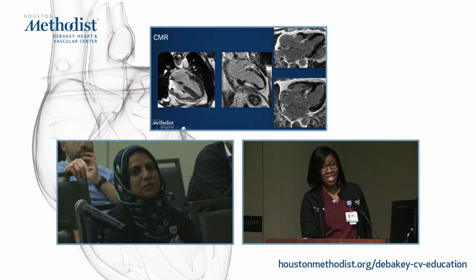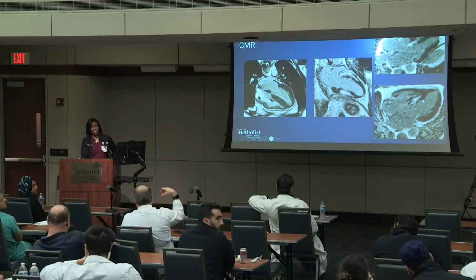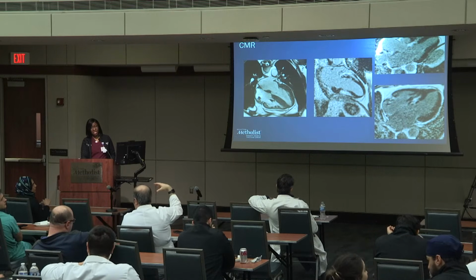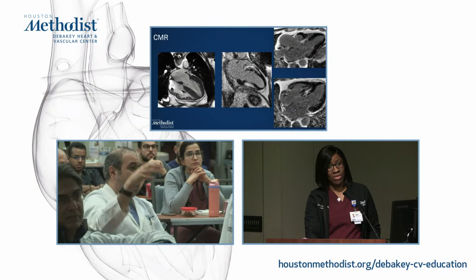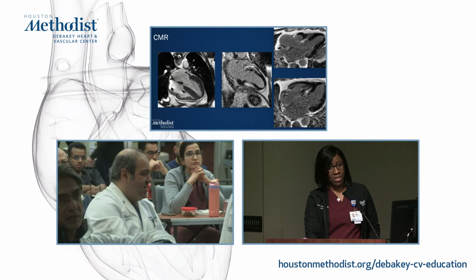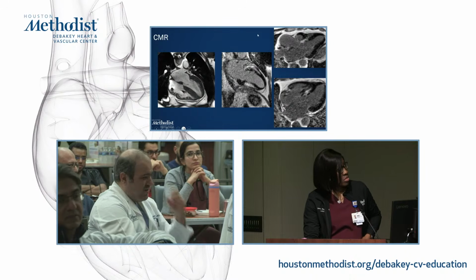And also the target of the ablation, to target the myocardium epicardially, you have to access the pericardium. So if you have an epicardial focus of VT, then that can create a scar burden, but not as homogeneous and very intense signal. But most VTs are usually endocardial. We have EP people over here.